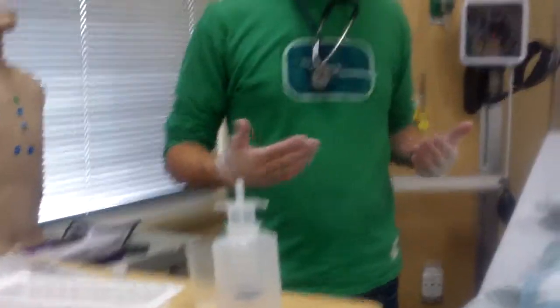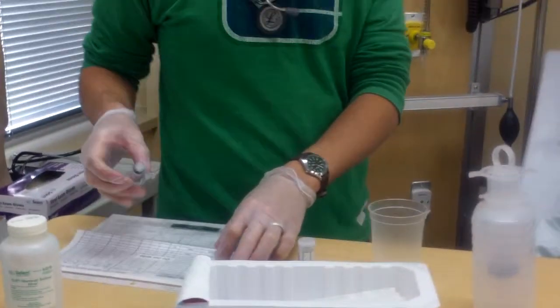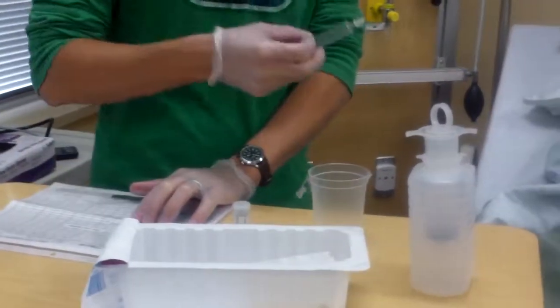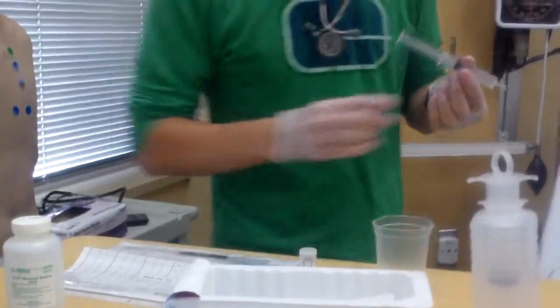And this is where I would do the third and final check. So I'd take my syringe here. You are indeed Jane Jones. Checking that against the MAR, I have the right time, date, route, patient, and the right medication. So I have all that. That's the third and final check, so that's good. I will then administer the medication.